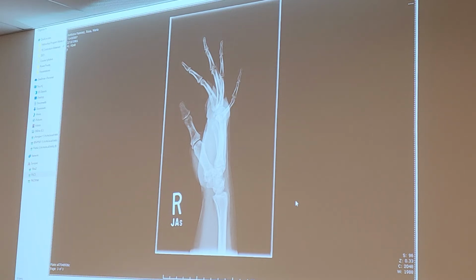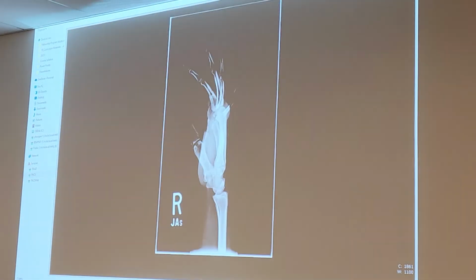That means, were these proper exposures? Yes. Do we have proper brightness? Yes. Can I still adjust this brightness after the fact? Yes. What is that type of processing called? Post-processing. And what two things can I do to it? Windowing and leveling.